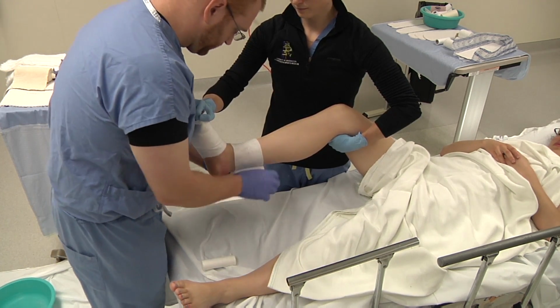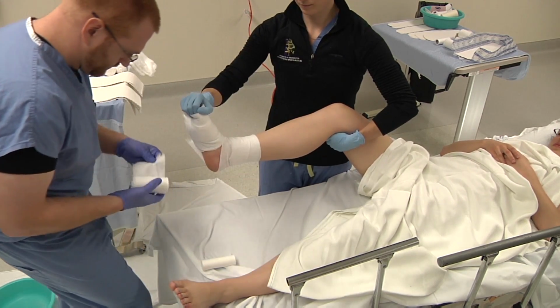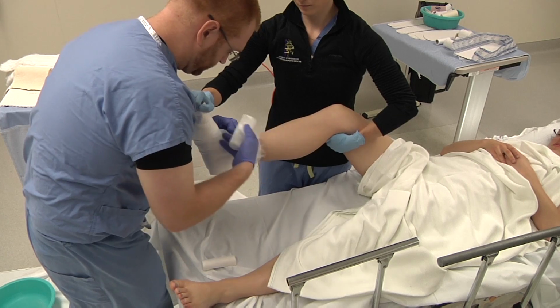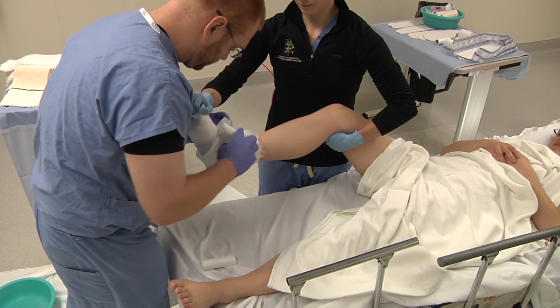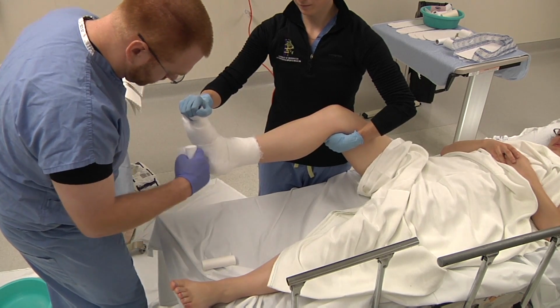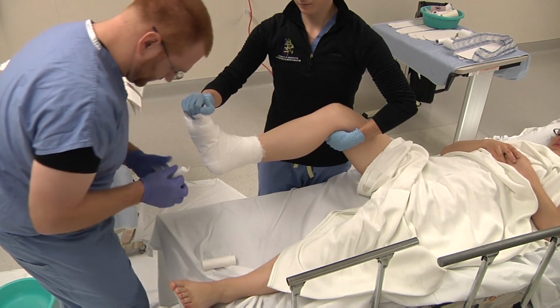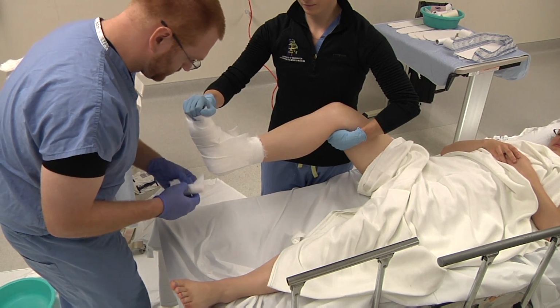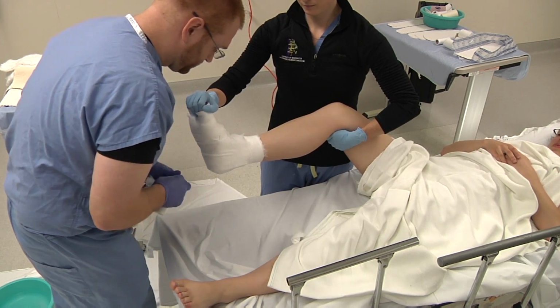From there, we continue to pad with cotton web roll. Paying special attention to areas of pressure, including the medial and lateral malleoli, the heel, cotton web roll can be torn to avoid any wrinkles that may cause later pressure points. Special attention, as previously discussed, should also be paid to creases where too much material can actually cause a constrictive response.